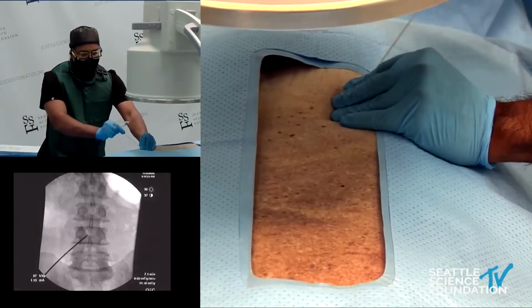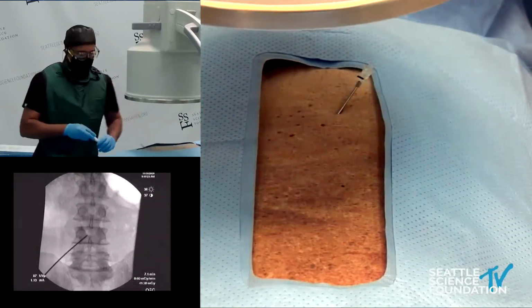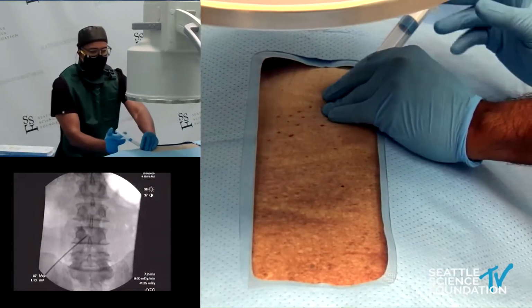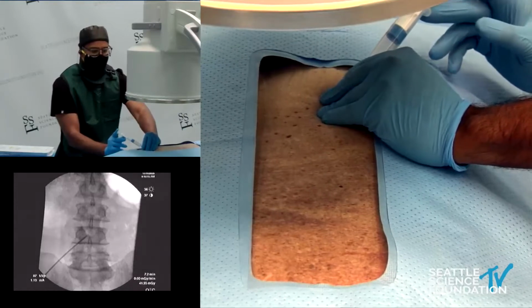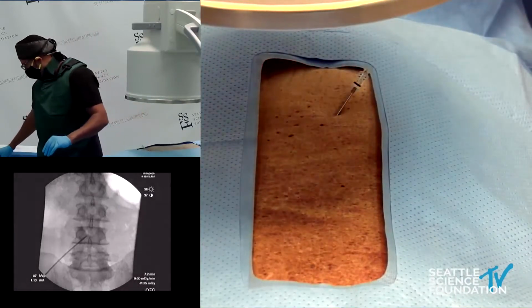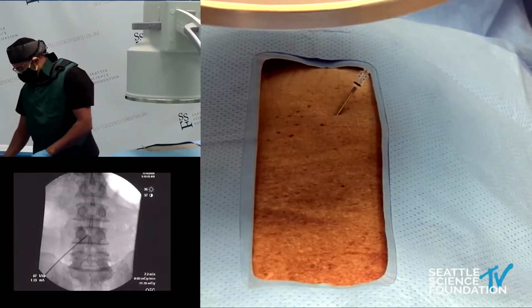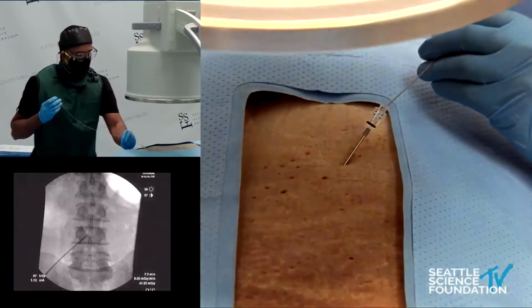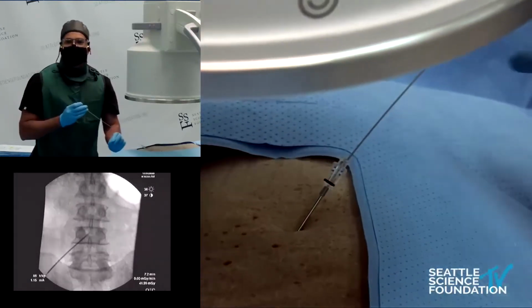So as I get closer, I shallow out my needle angle, and I'm hoping to enter right around midline here. That might be a little bit early here. I'm going to check with a guide wire just to see how easily this goes. As you know, cadavers have different feels, so we'll just see how well this goes.